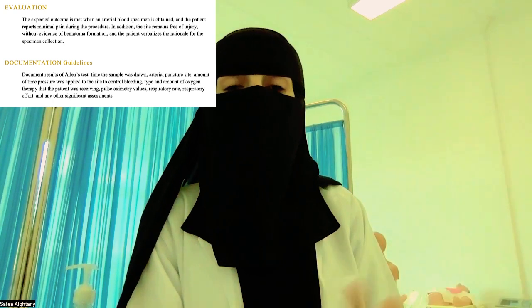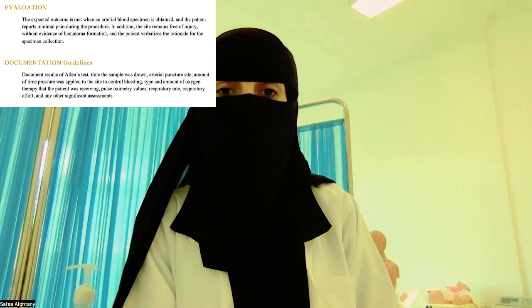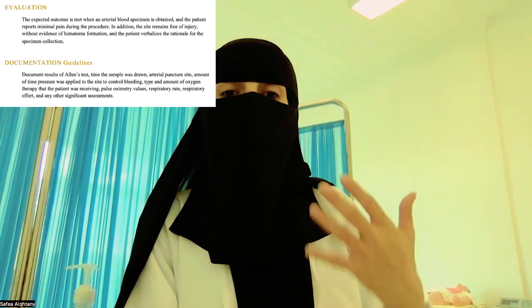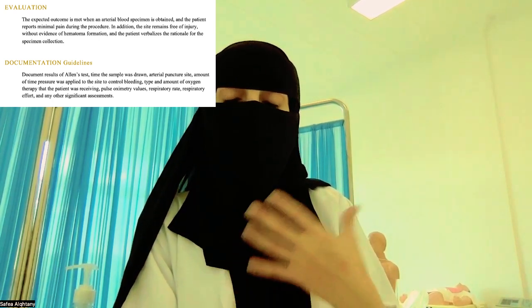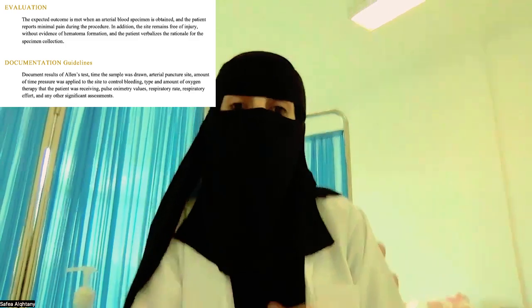Also, I need to document the patient tolerance and response to the procedure. هل تحمل البيشنت هذا البروسيجر أو إنه يحتاج نعطيه for example مسكنات or analgesia before we insert the needle in the future. I need also to document the patient respiratory status، يعني depth والrhythm of the breathing، عملية التنفس, rate as well, and the oxygen saturation level. So this is all that we need for this procedure in order to obtain arterial blood gas sample.